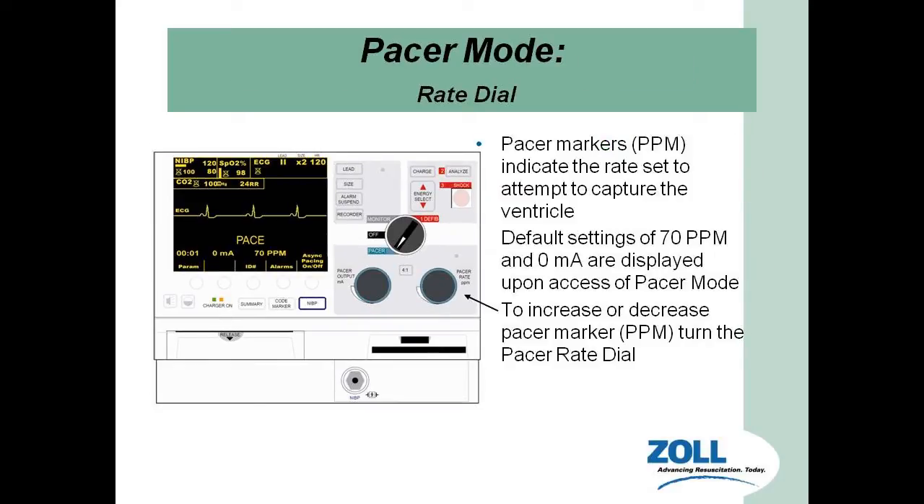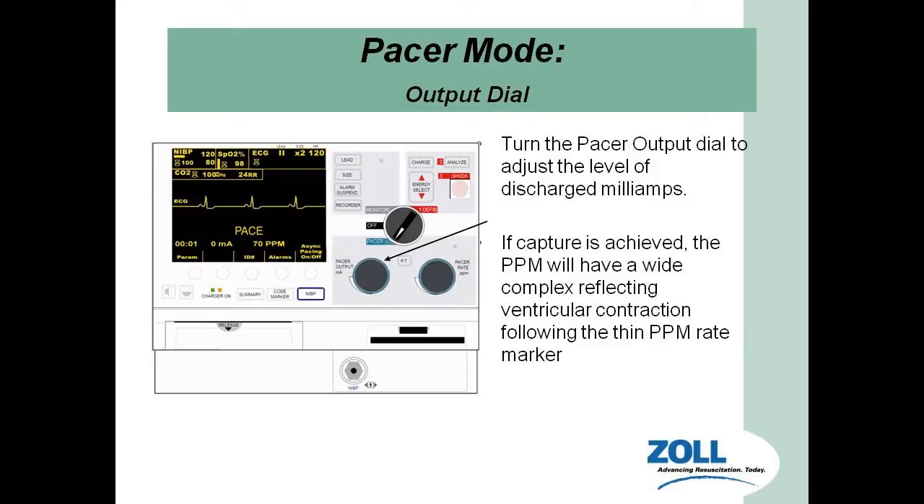Let's talk about the rate dial. It's a little different than some units we used to have, like the LifePack 11. On this one it's a spindle, and it automatically defaults down to about 70 beats per minute. Leave it at about 70 to 80 — that's our working range. The next dial over is in milliamps. The rate is how fast the heart's going to be beating. The milliamps is how much energy is going to be delivered every time the pacer attempts to capture. Our goal is to keep it at the lowest possible milliamps to do less damage to the heart itself.